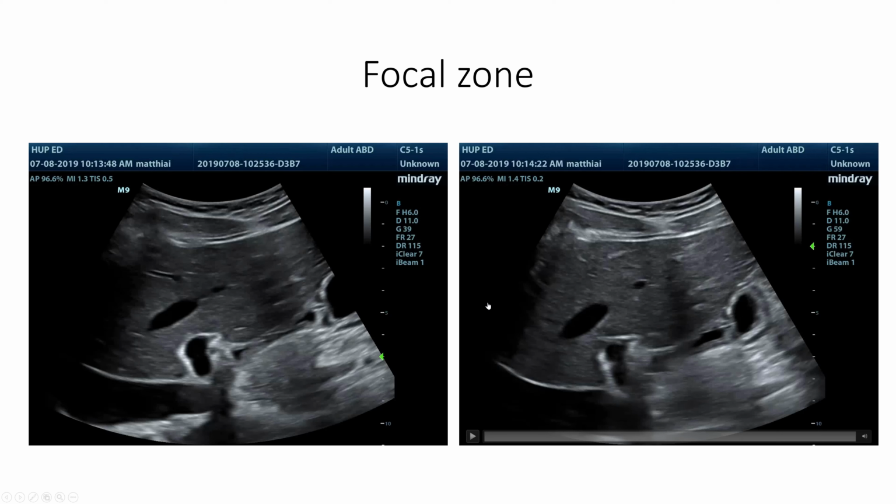Okay, so we're moving along the poem. We've gone on to the line that goes focal zone. So what did we do? We did depth, we did gain, and now onto focal zone.